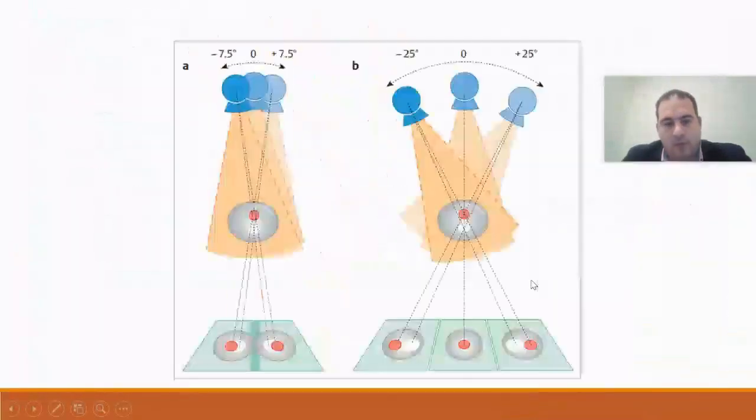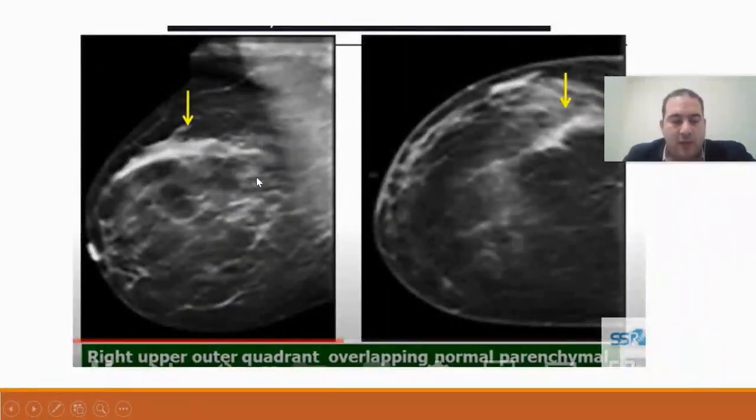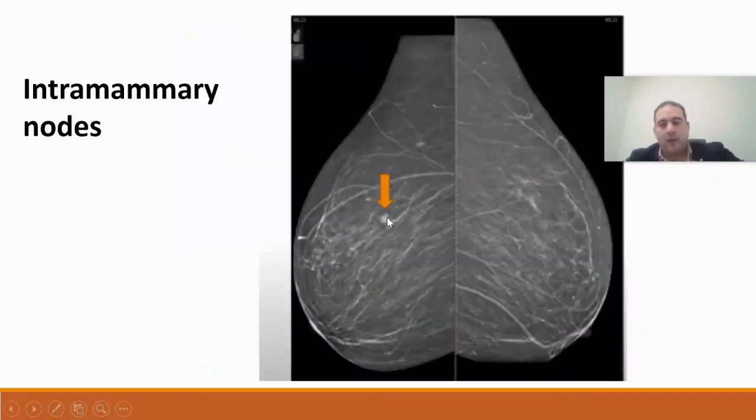In regular mammography, for example, in a normal screening using a single view and not tomosynthesis, you might see a specific problem or lesion, and you may have doubts about whether this is a problem or a mass, or if there is a specific tumor present inside the breast. Because you take different sections of the breast, it becomes clear that this part is something like parenchyma, not sections present in the breast. Such things appear in the normal projection, or in regular mammography, as if they are imprecise masses.